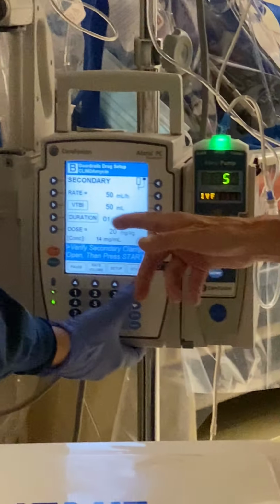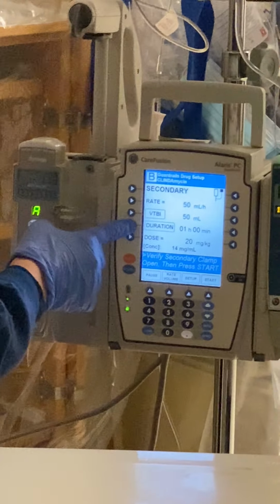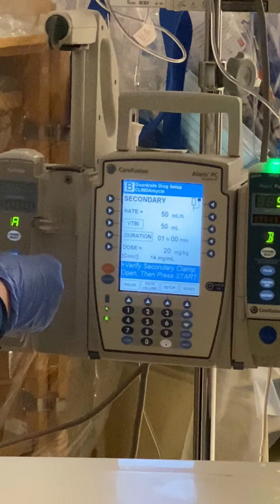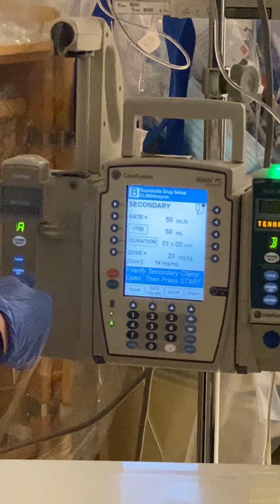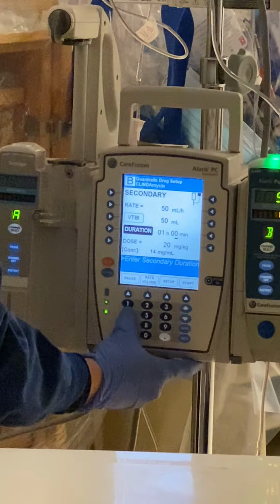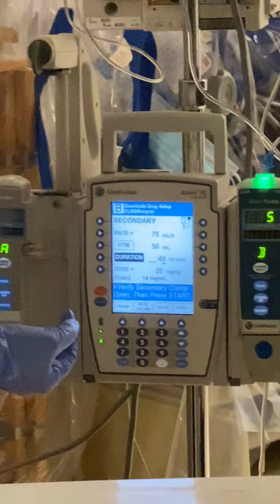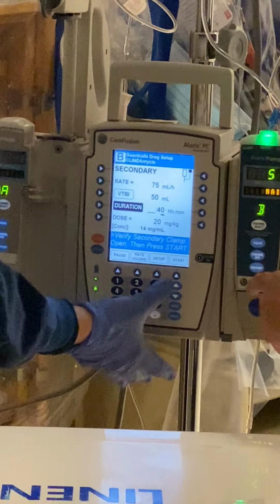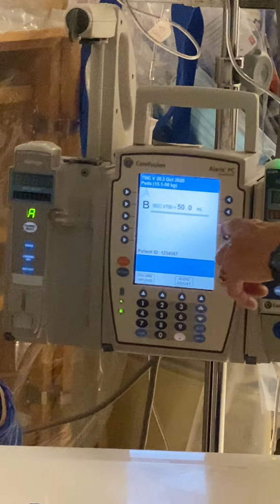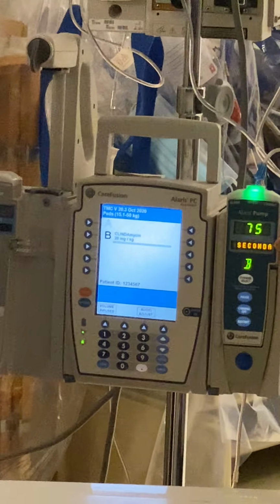Now this one says it's going to infuse over an hour. What does your order say? 40 minutes. Okay, sometimes they'll match, sometimes they won't. So hit duration and then hit 40. But you need to recognize that because it's got to match the rate that you told us it was going to infuse. 75. So 40 minutes, okay. If you hit start, it's going to say 75 milliliters per hour, which is the rate that you all calculated in the med room, which is awesome.